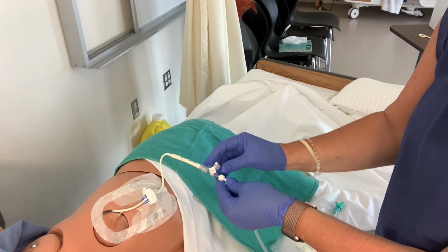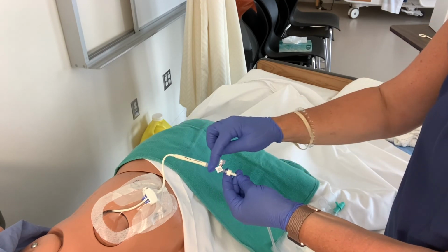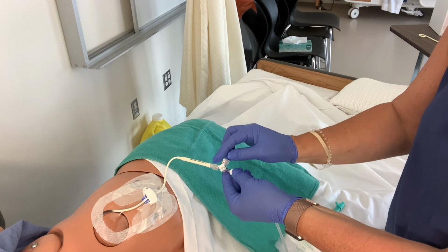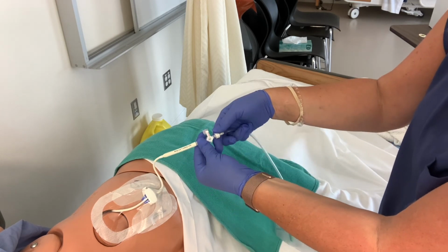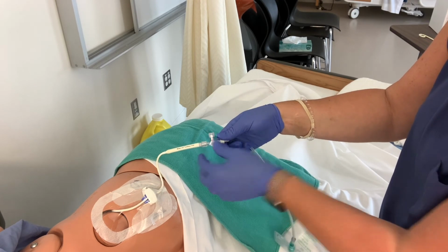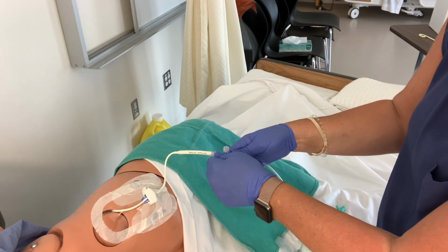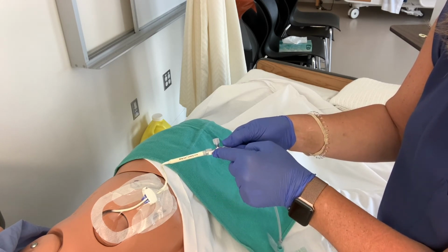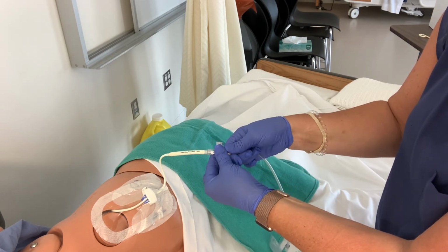But that's okay, just ignore it. You're not using it anyway, it's turned off. That means that the highway for fluid to drain is open. It has red letters there, off. So anytime I want to open the system to the patient, to flush it, to do anything, I want to turn it off to the patient, so it says off to the patient, and therefore I can do whatever I need to do.